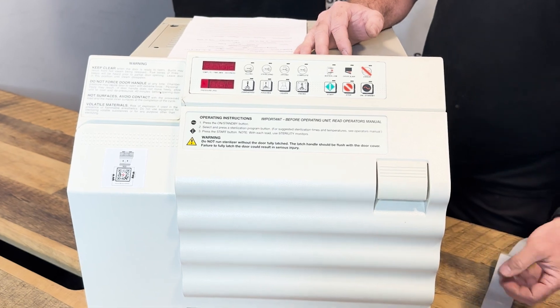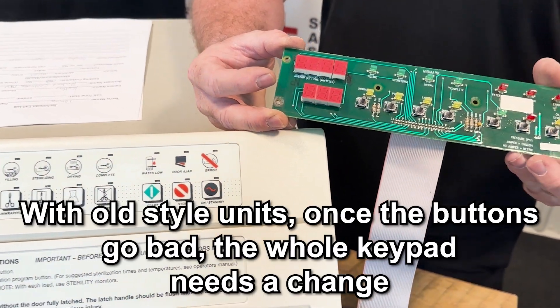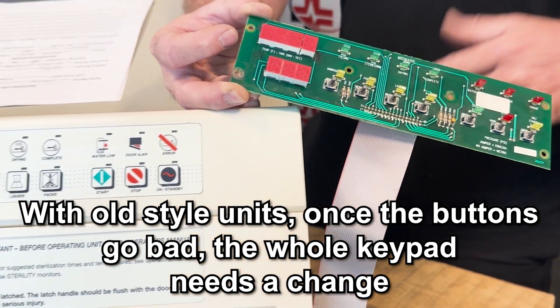So we troubleshot it. With the old style, the only particular thing that you have are these buttons. So once these start going defective, you need to replace the entire keypad because the unit will essentially be non-functional.